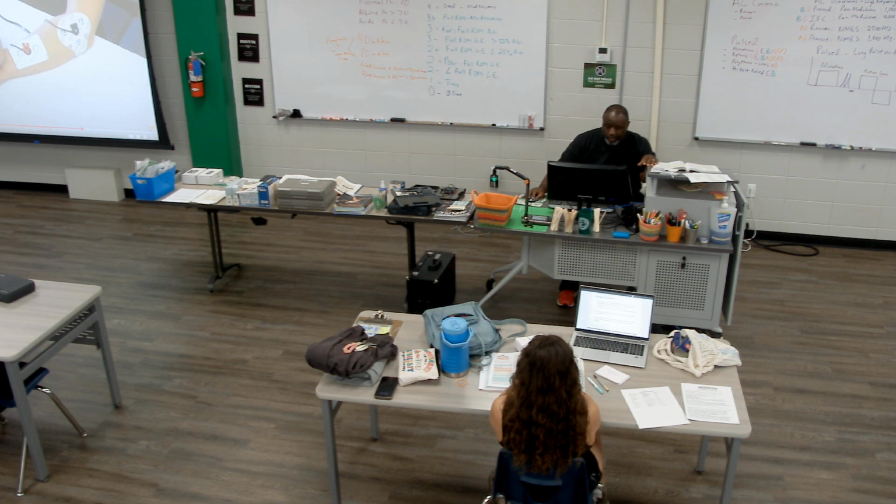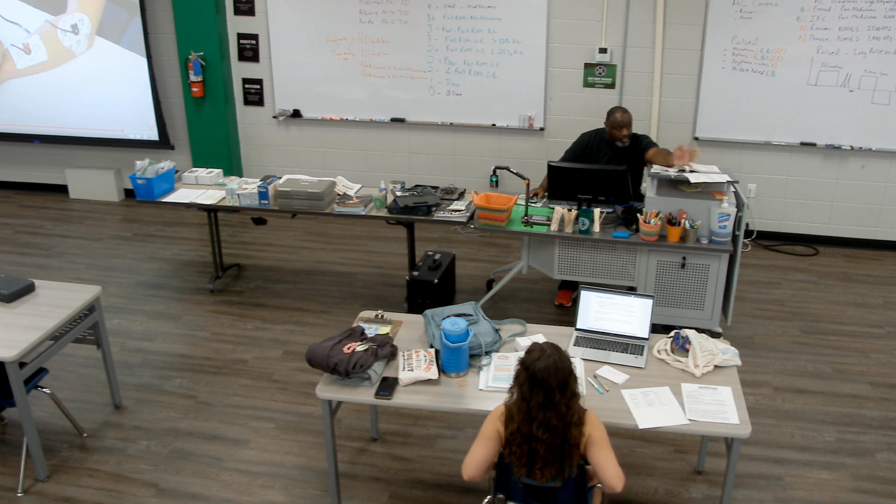Okay, now turn to the right, and that's setting the amplitude. And it goes all the way up to 4. So now they're at 1 milliamp, 2 milliamps. Now they hit start. Check in regularly with patients. Because they have 2 milliamps of current and they're doing a 40 milliamp minute dose, the patient is going to require 20 minutes of total time to have this done. Does that make sense? So if they went all the way up to 4 milliamps of current, then the patient would only need 10 minutes to get this done.